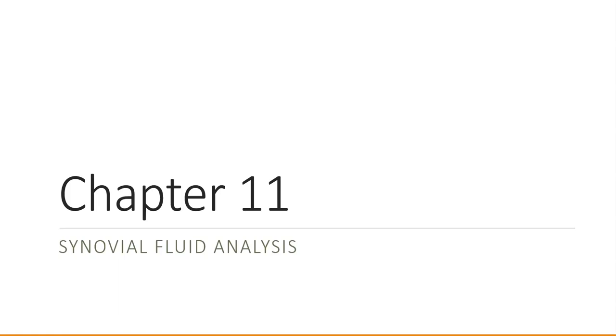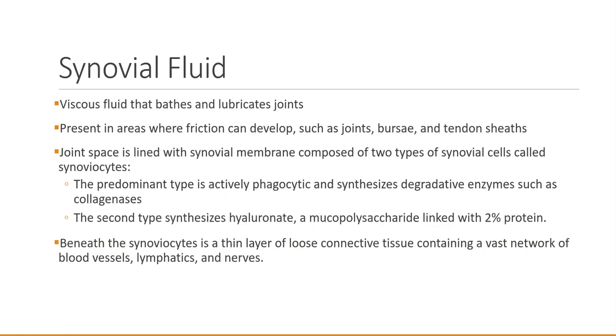In Chapter 11, we will discuss synovial fluid analysis. Synovial fluid is a viscous fluid that bathes and lubricates your joints. It's present in areas where friction can develop, such as your joints, bursae, and tendon sheaths.